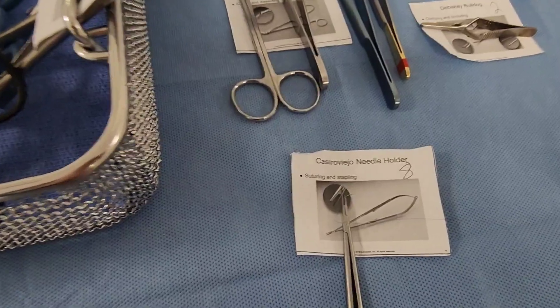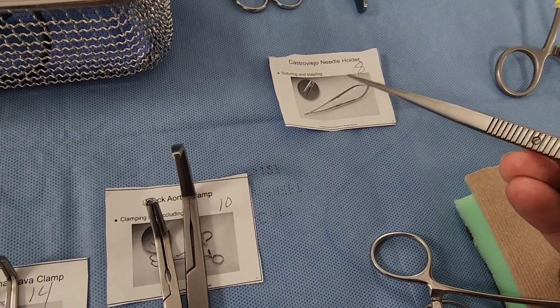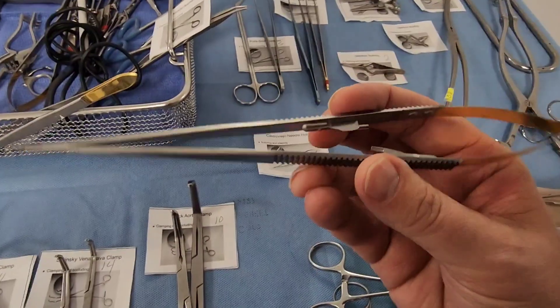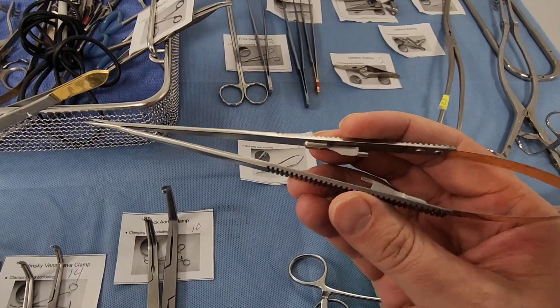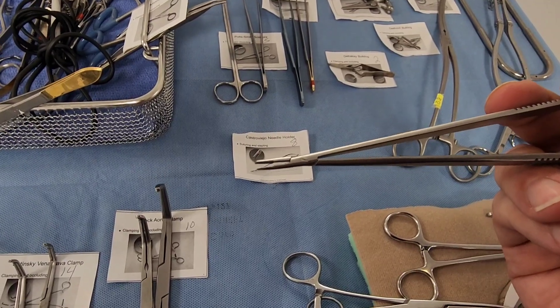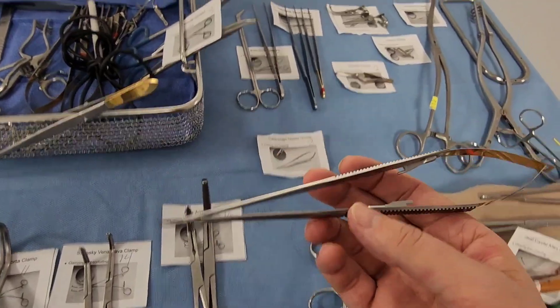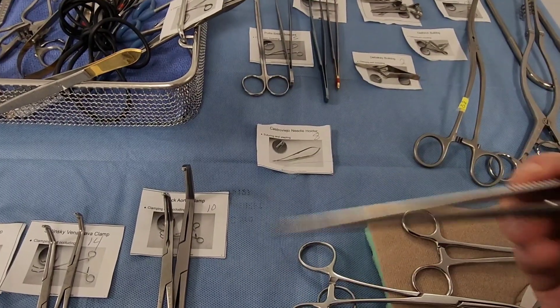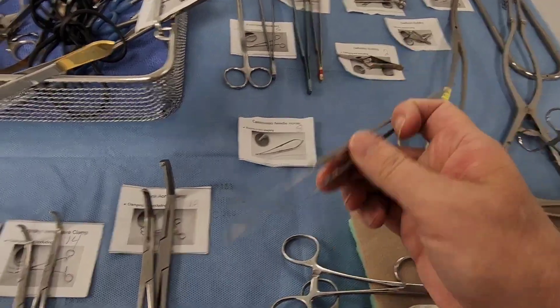This is the Castroviejo needle holder — it has a lock-in mechanism. You can see it has a locking clamp so you don't have to squeeze it tightly, but make sure they function correctly as these can malfunction. They're used for very fine small sutures — 7-0, 8-0. While used in eye and neuro cases, in vascular the Castroviejo is typically for these smaller microsurgery-type sutures.